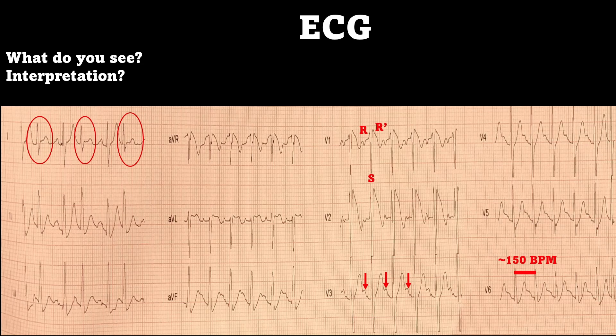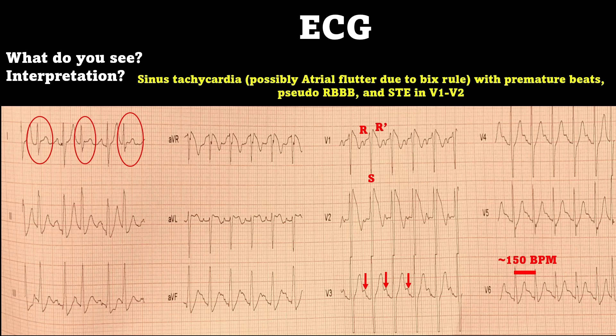It's probably a PJC because they're also a narrow complex premature beat. This is going to be a sinus tachycardia, but there's a possibility it could be a 2-to-1 atrial flutter due to the BICS rule. The BICS rule means there's atrial activity halfway between two QRS complexes, and possibly inside each QRS as well, which would coincide with a 2-to-1 flutter. Since this patient has a heart rate of 150, we could do a Lewis lead to confirm this.